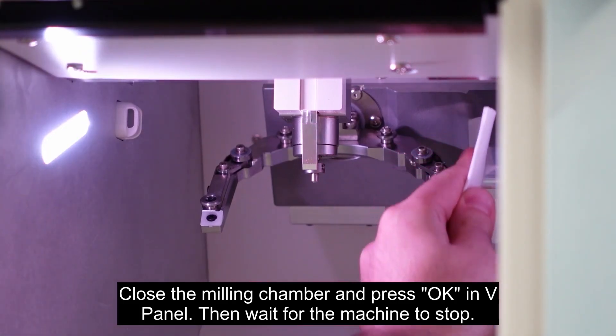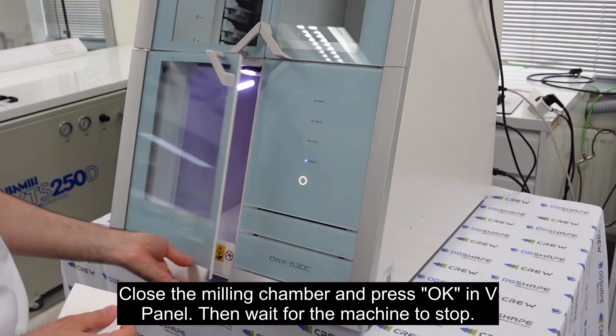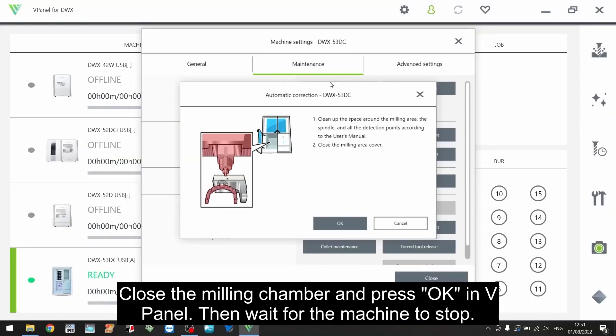Close the milling chamber and press ok in v-panel. Then wait for the machine to stop.